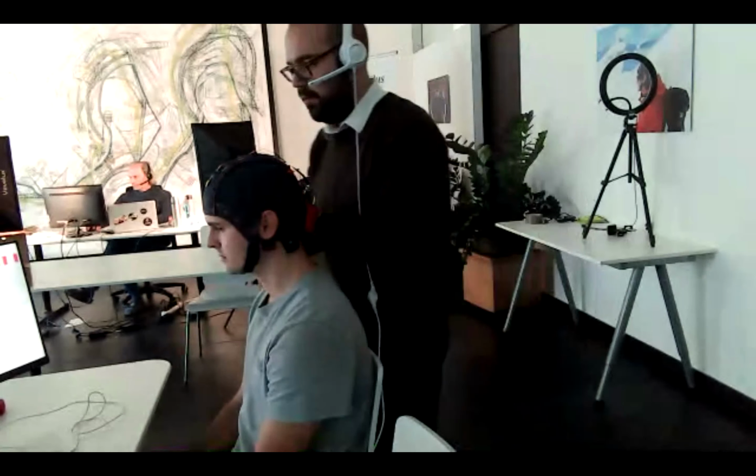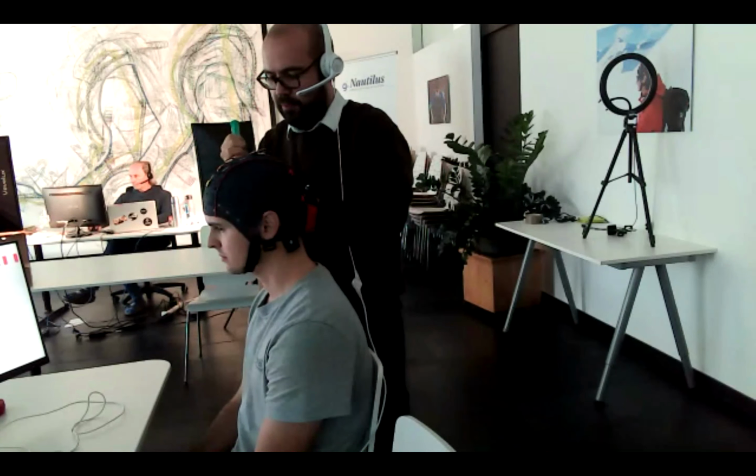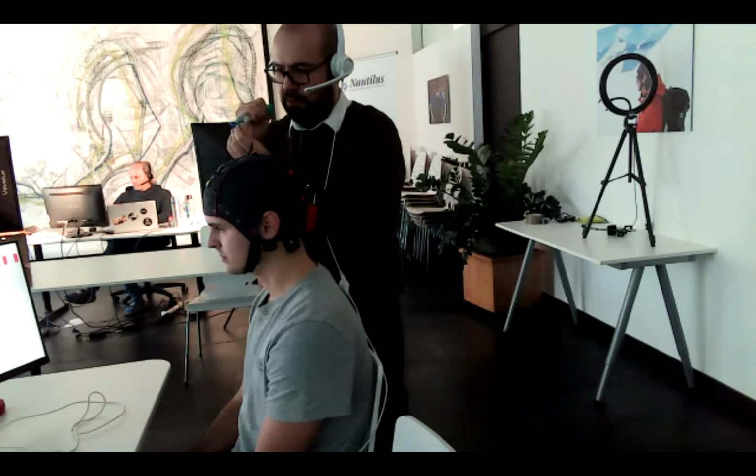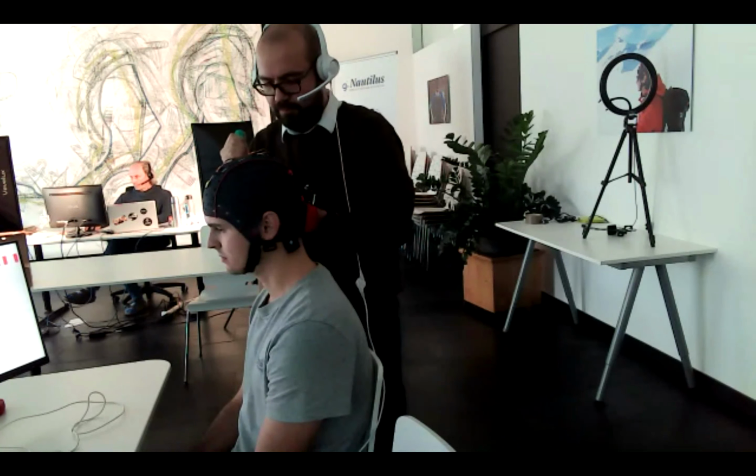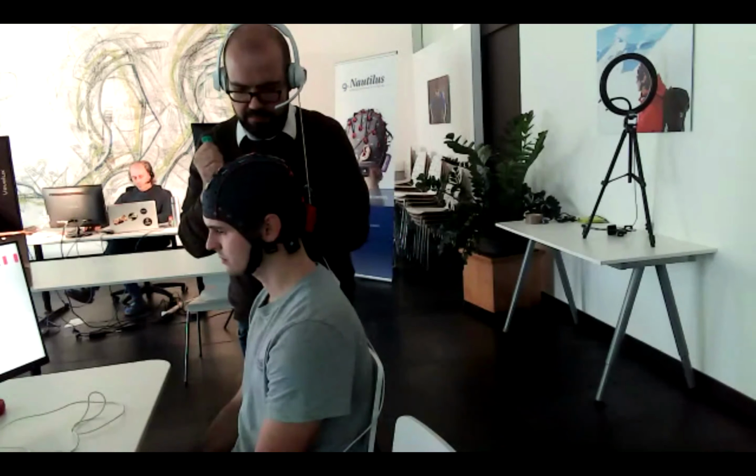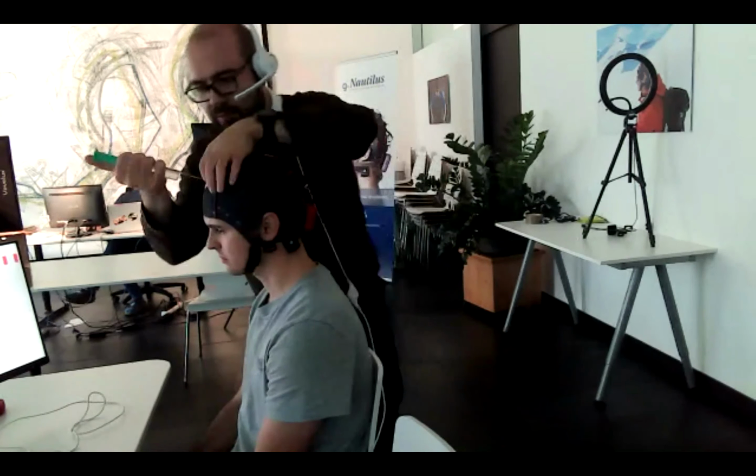I will start with the reference, which is on the other side of the head, but you can see it here. And I can put it on the front.